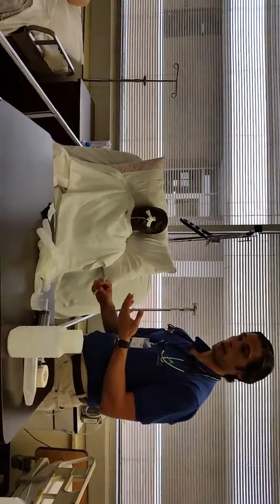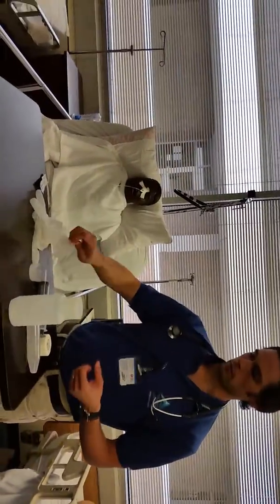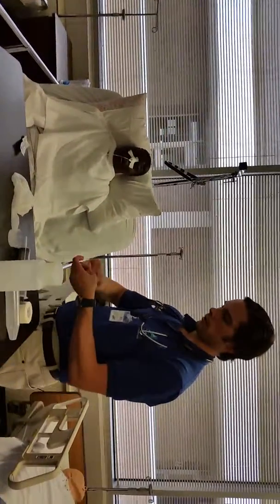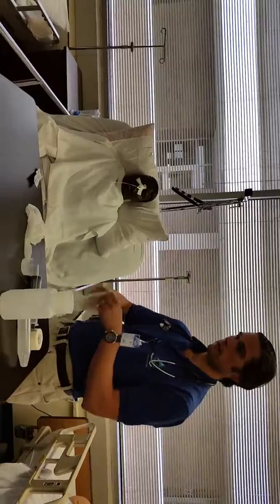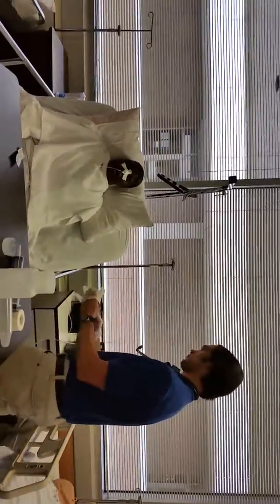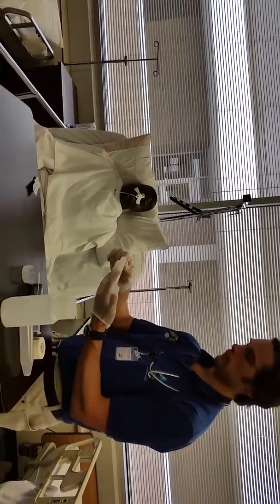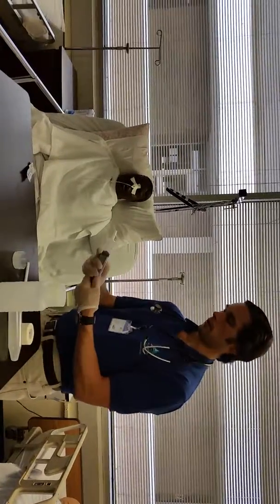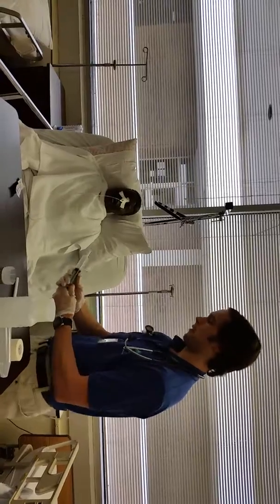And now for irrigation, I check my standard protocol, see what the doctor wanted me to irrigate the NG tube with. I'm going to wash my hands and don my gloves. I'm going to disconnect my suction, which I already did. I'm going to draw up 30 cc's of air.